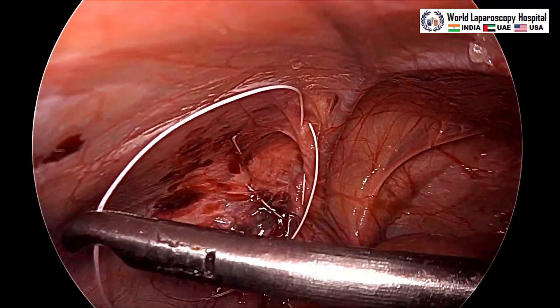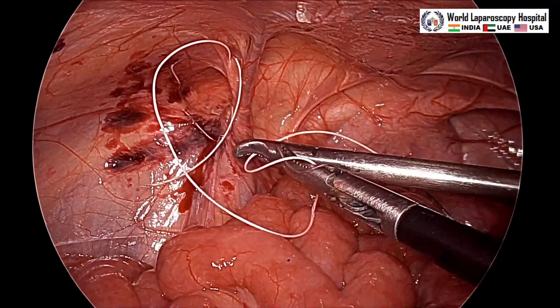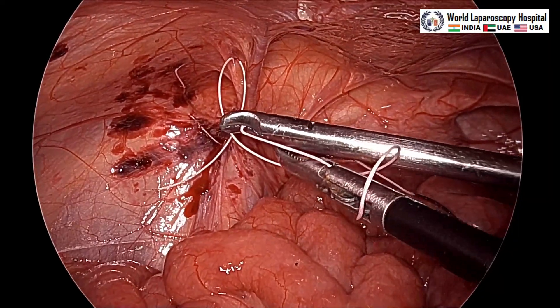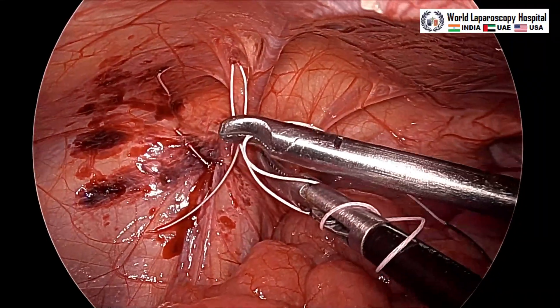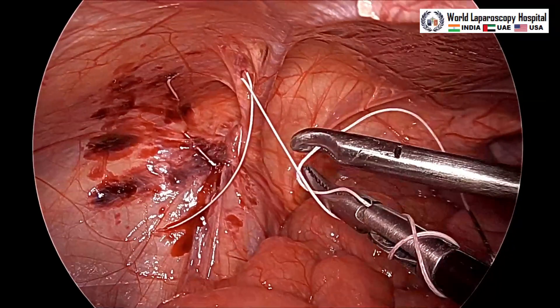After that we will tie the knot. We will take three wraps so that after taking the bite it should not slip back. Generally in a surgeon's knot we take two wraps the first time, but here three wraps will be taken so that it will not slip back.